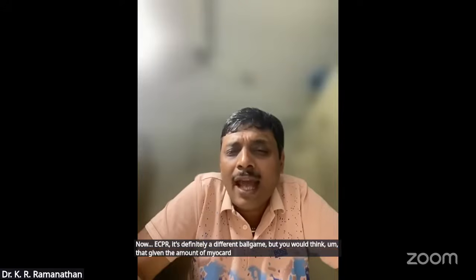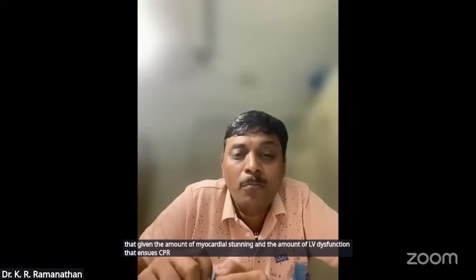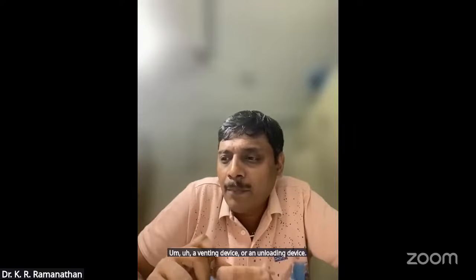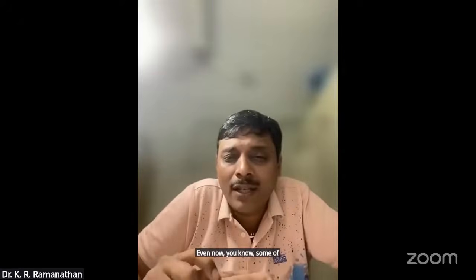Now, ECPR is definitely a different ball game, but you would think that given the amount of myocardial stunning and LV dysfunction that ensues after CPR, these patients would benefit from a venting device or an unloading device. We were using it very regularly. Even now, some of our patients do get it.